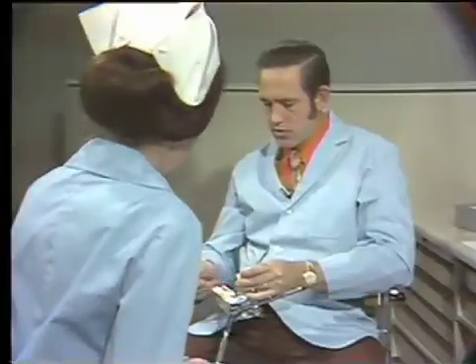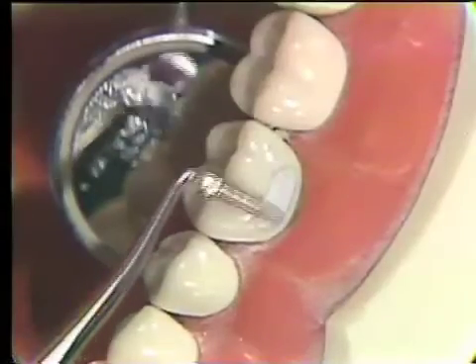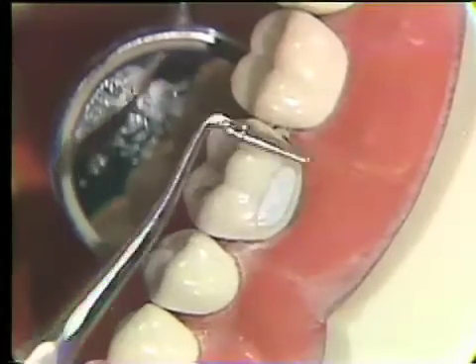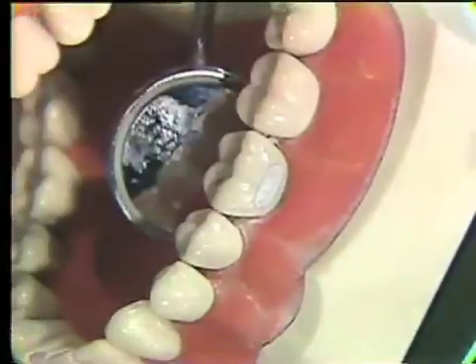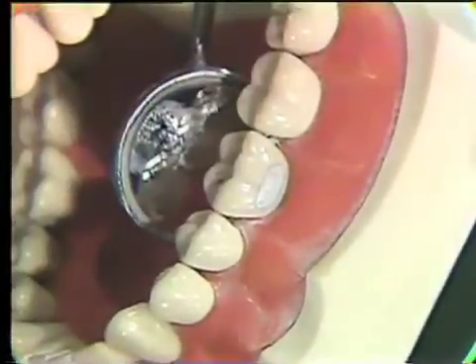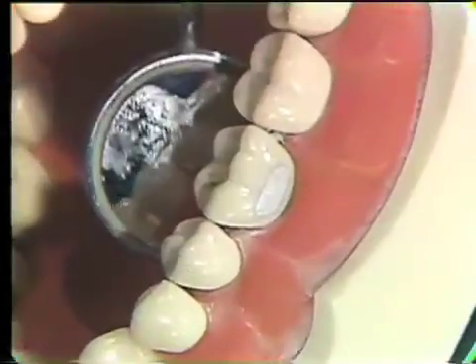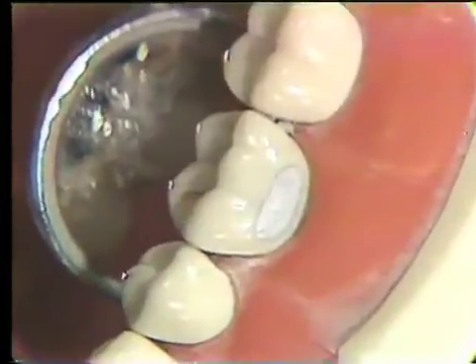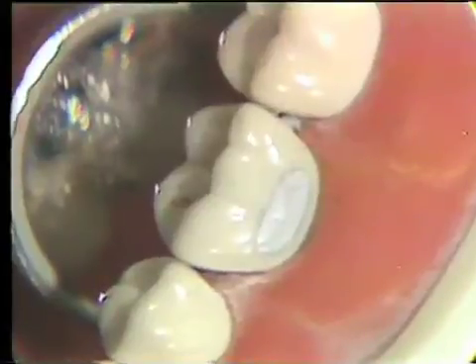After this is carved, you may want to burnish it again to get the final surface texture. We may do this with a Wesco burnisher, which the systems will also have for you. This will just help to smooth the surface and give it that final texture. So you can see there isn't really a great deal of difficulty in doing this type of restoration. It's fairly simple and shouldn't take as much time. If you have the time available, we ask that you try to remove it and do it again to get as much experience as possible in the limited time you have.